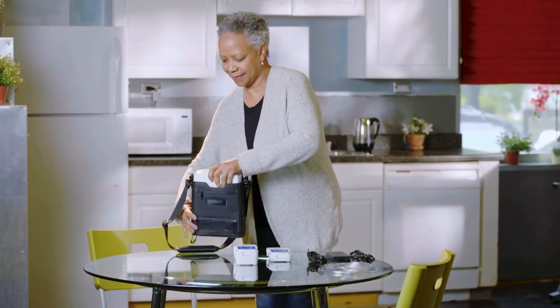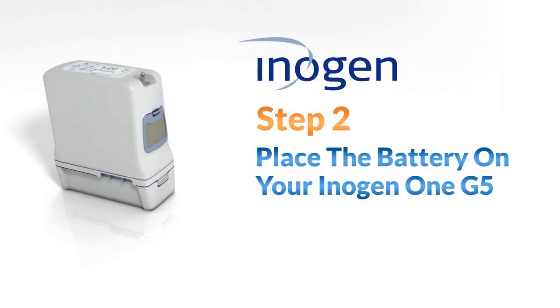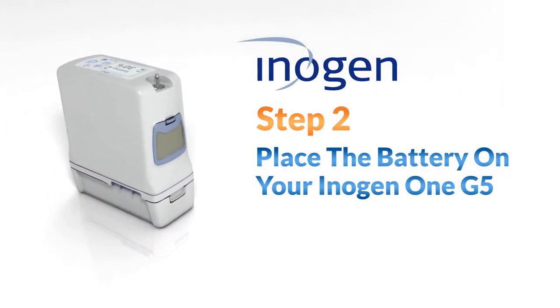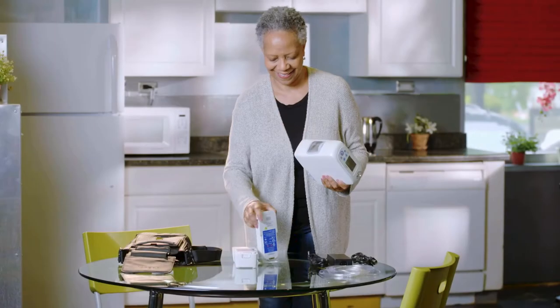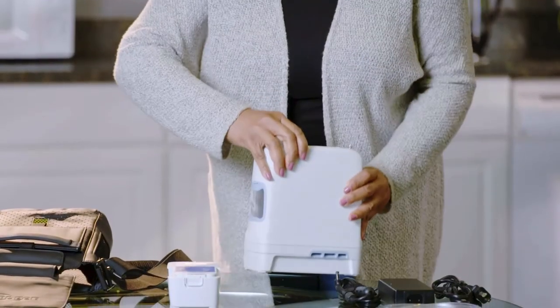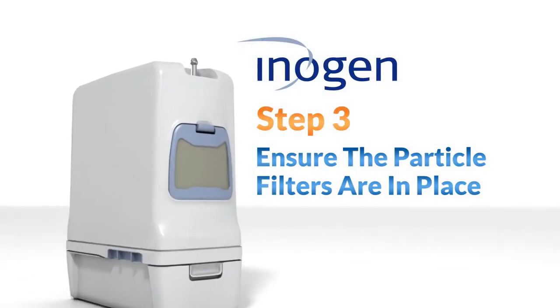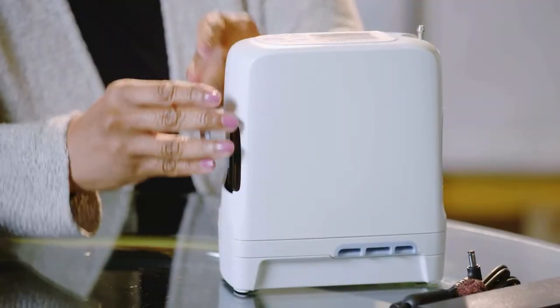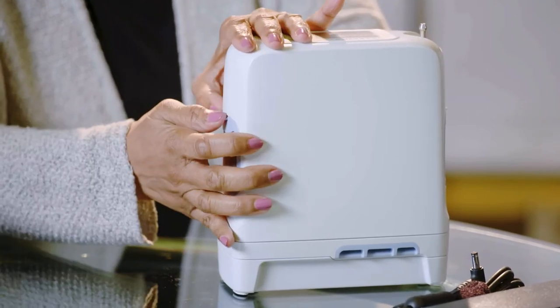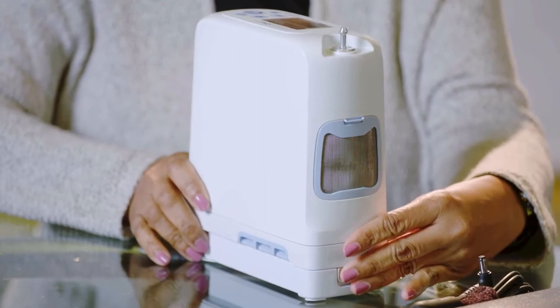First, remove the Inogen 1 G5 from the carry bag. Now, take one of the batteries and slide the battery into place at the bottom of the concentrator. Now, ensure that the particle filters are in place. Do not operate the Inogen 1 G5 without both particle filters in place.